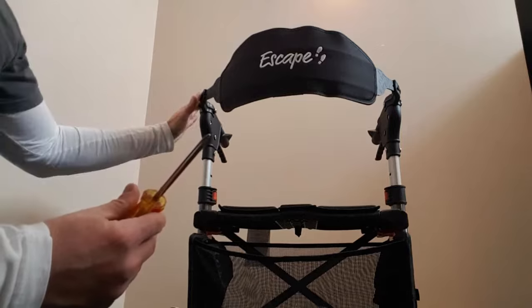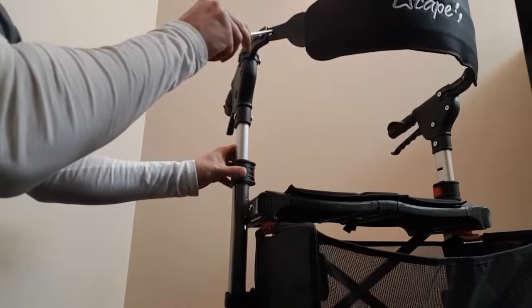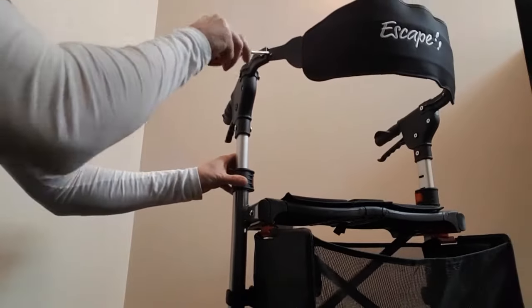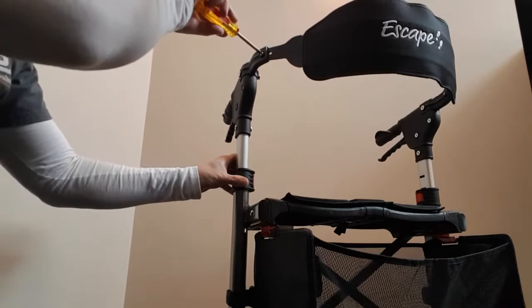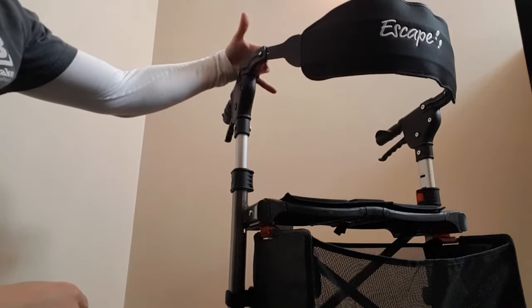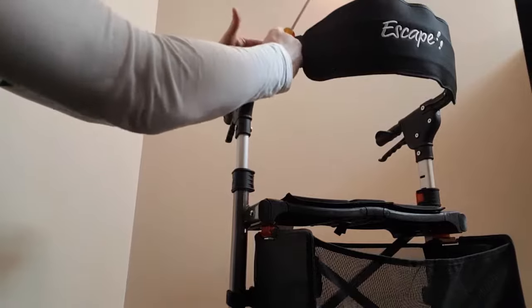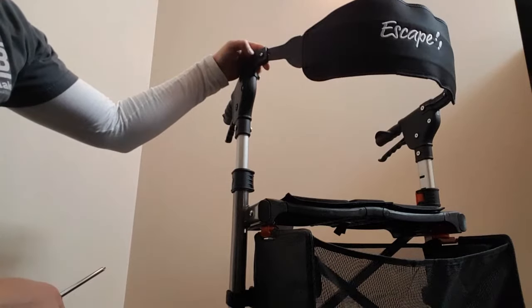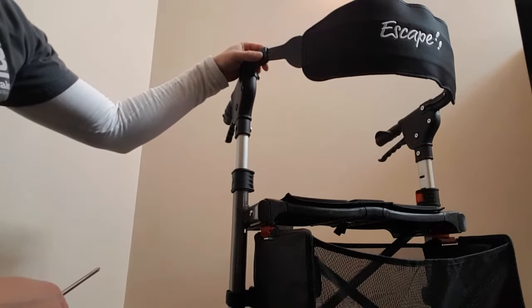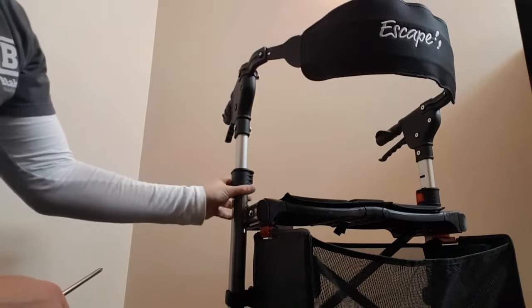Like a lot of other backs out there they are depth adjustable, so you need to get your Phillips screwdriver and as you can see there's an adjustment point right here. We can just back this screw off here. There's a self-setting nut on the inside of the housing and we open that up, moving the backing closer to the client to capture them a little bit better, make them feel a bit safer and more comfortable if they feel this position is too far away from them.